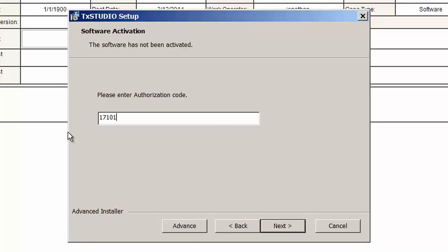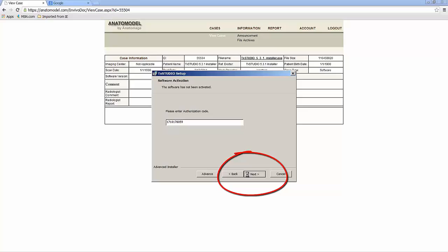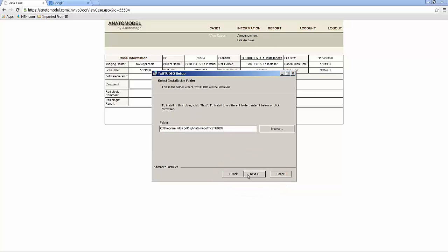One perpetual license must be installed first on the network. It is a single license that will be needed to run any network license. Any additional perpetual licenses may be installed on the same network, used on a notebook that travels out of the office or on a home computer. A network license will install from 1 to 4 computers with all the capabilities that a perpetual license has. However, the computers with network licenses must share the same external IP address with the computer that has the perpetual license.